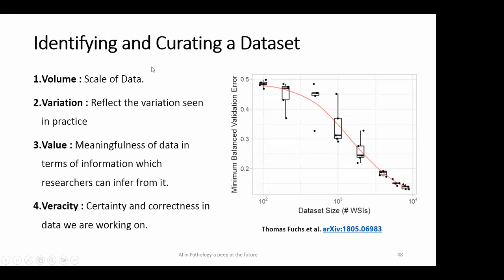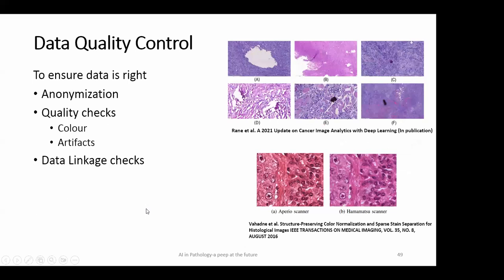A lot of the other things, whether the data is meaningful, whether it is accurate or not, is where the pathologists and clinicians come into play in deciding what data is fed into the AI model. The AI model is also affected by a lot of the artifacts in histology images: the variation in color, lab-to-lab processing, inter-laboratory variations, color differences across different scanner types and tissue types, fixation, and a lot of these pre-analytical variables that arise from our current pathology processing, fixation and staining processes.